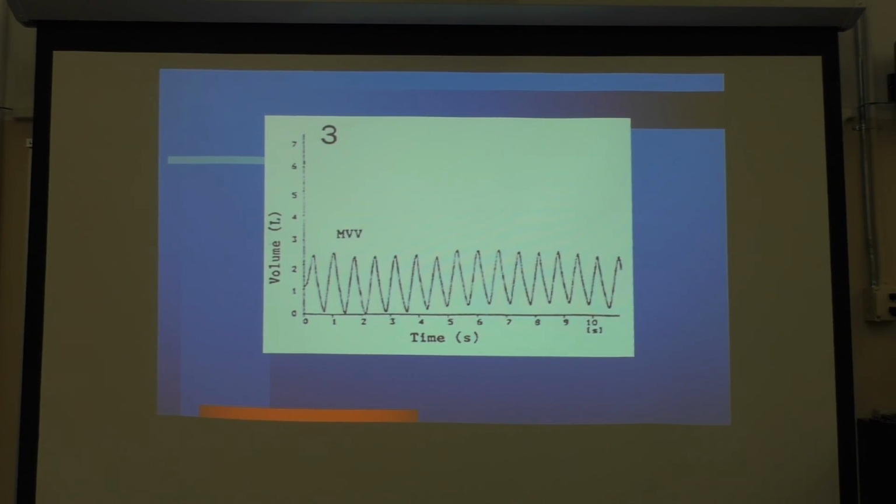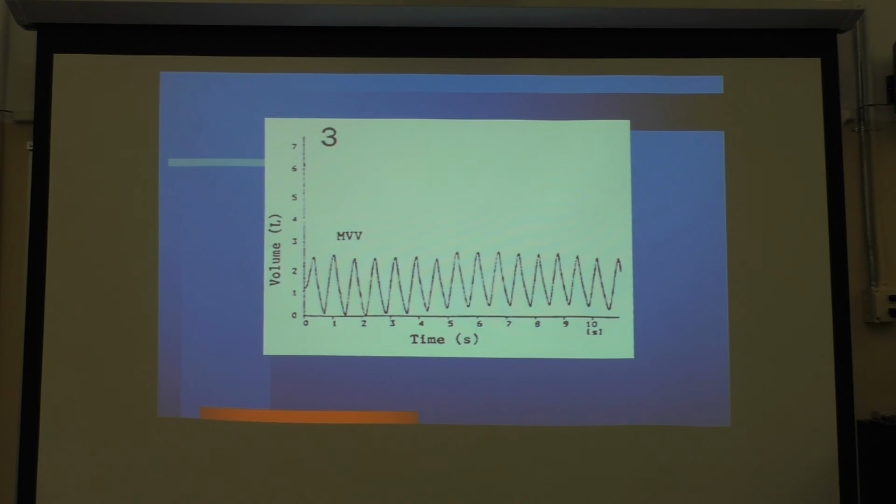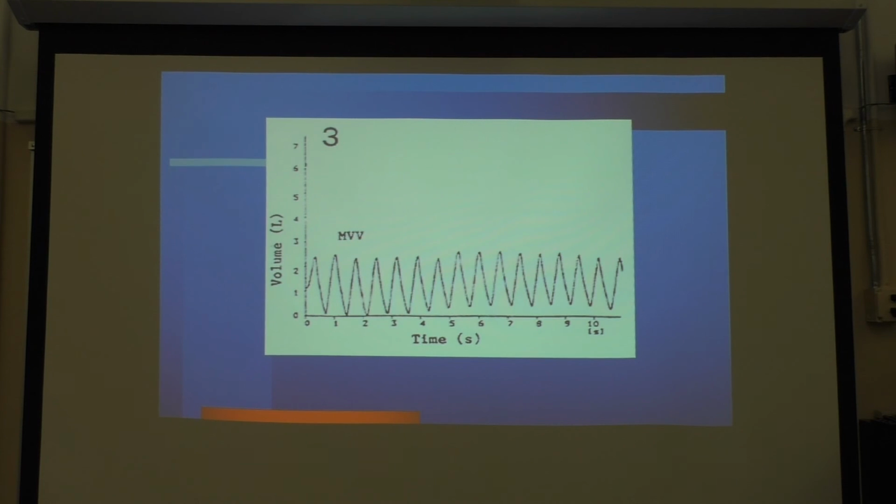This is an output of an MVV test, or maximal voluntary ventilation. And you can see here all the individual's doing is purposefully hyperventilating in and out as hard and as fast as they can. It actually occurs for a period of 12 seconds. And as we'll talk about later, that actually has ramifications in that MVV is, well, even though it's in terms of liters per minute, we're only collecting data for 12 seconds.